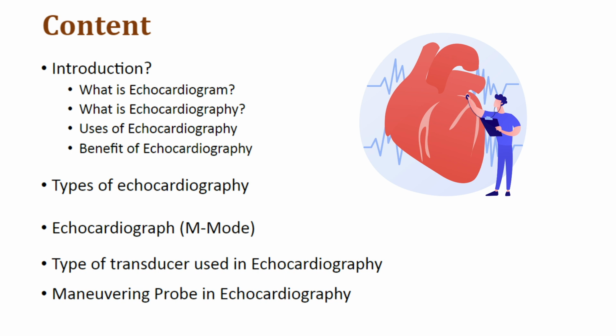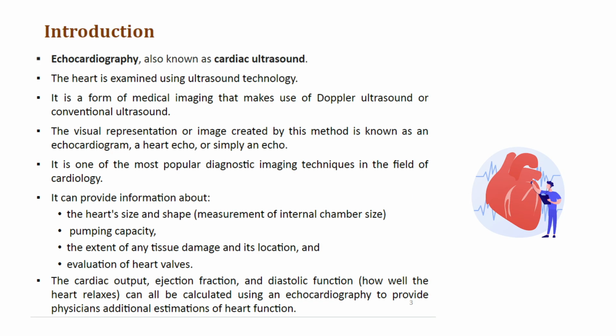Now, we are going to see what is echocardiogram and echocardiography. Echocardiography is also known as cardiac ultrasound. In echocardiography, heart is examined using ultrasound technology. Echocardiography is a form of medical imaging that makes use of Doppler ultrasound or conventional ultrasound for cardiac disease detection. The visual representation or image created by this method is known as an echocardiogram, a heart echo, or simply an echo. It is one of the most popular diagnostic imaging techniques in the field of cardiology.